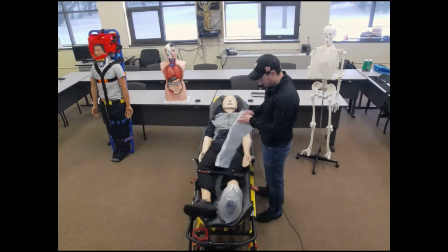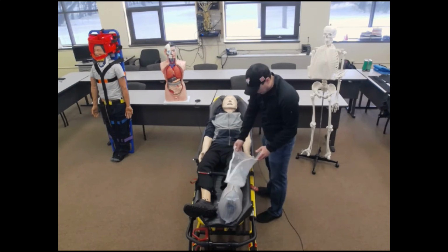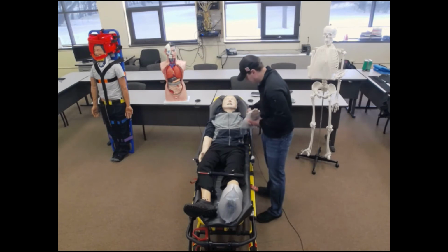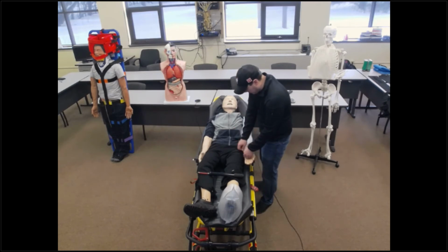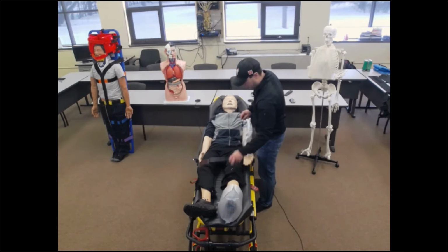Same technique, it's got a zipper application. So I'm going to go ahead, check CMS on the patient. CMS is good. Apply my splint. They have a forearm injury. I've identified that. There's no bleeding or anything associated with it. Go ahead and zip it up. Take your air hose.